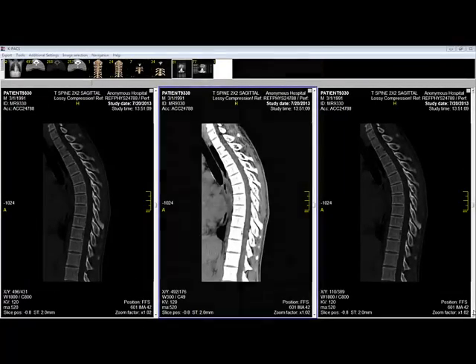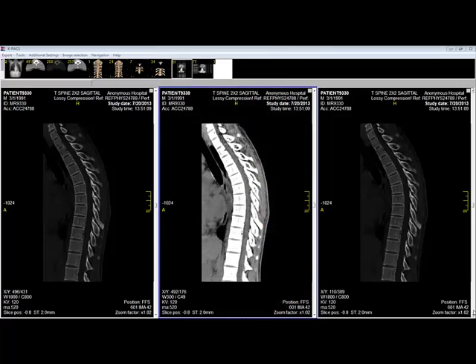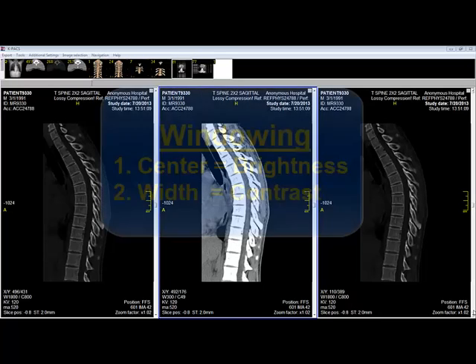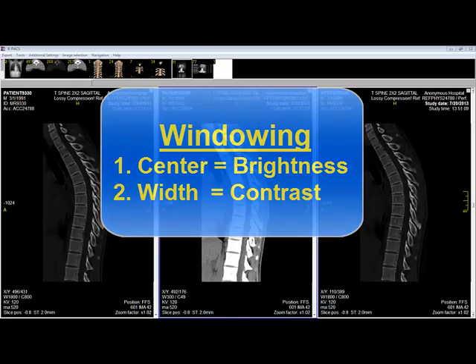Because different tissues have different radial densities, as seen in this table, it is important to be able to adjust windowing width and windowing center to optimize the viewing of each tissue. If you are familiar with light photographic techniques, you can think of adjusting windowing center as similar to adjusting the brightness of a photograph, and adjusting windowing width as similar to adjusting the contrast of a photograph.